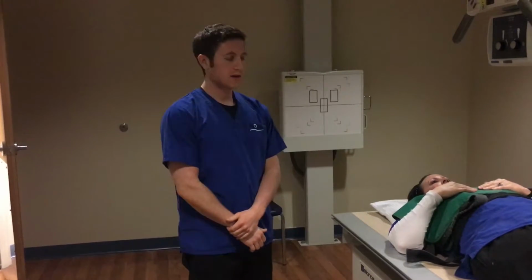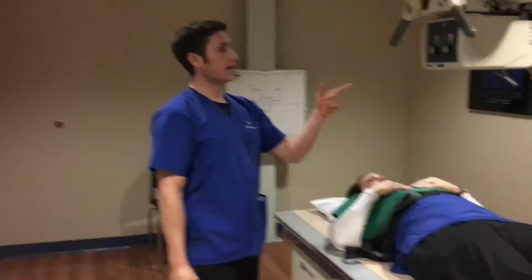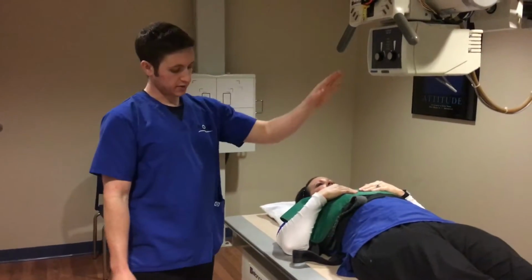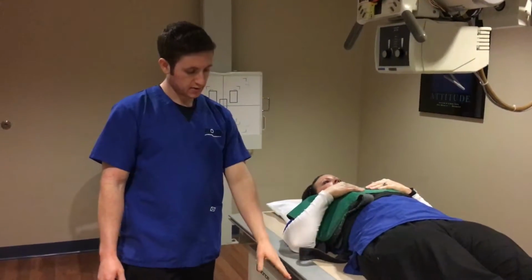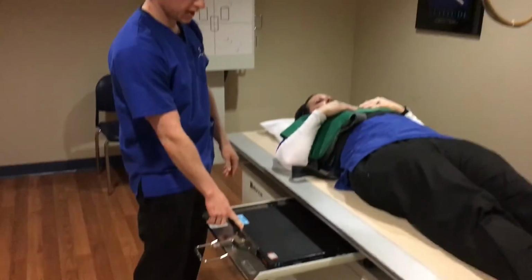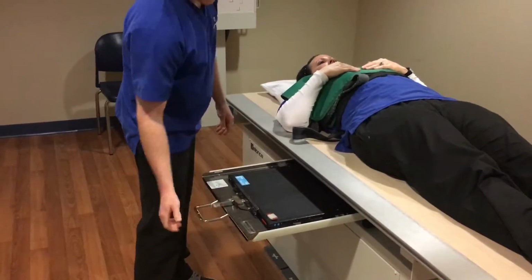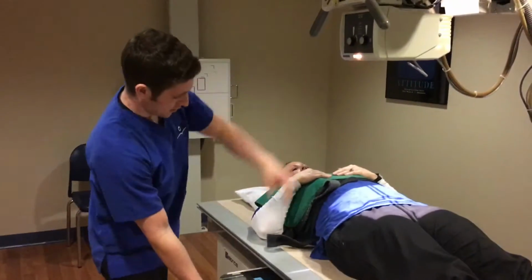Okay, so now we're ready to do the AP pelvis projection. We're still screening for Paget's disease here. I've got my 40-inch SID again. That's 40 inches to the table bucky. I've got a 14x17 cassette in the table bucky crosswise. I've got my right marker down here in the bottom right corner. And it's lined up with my tube.